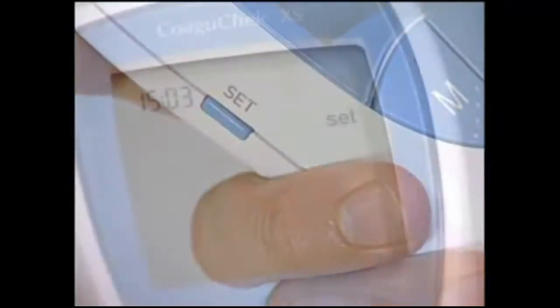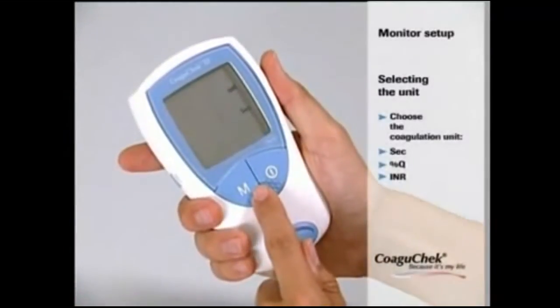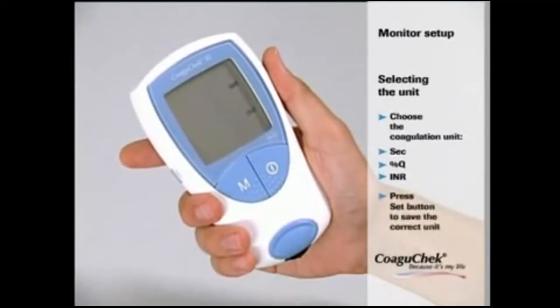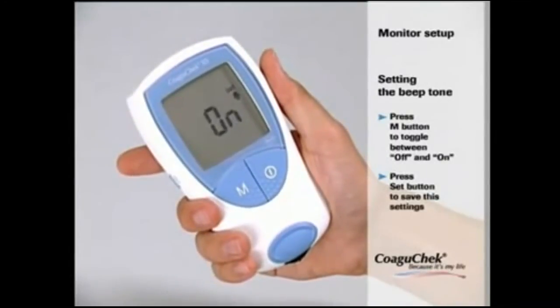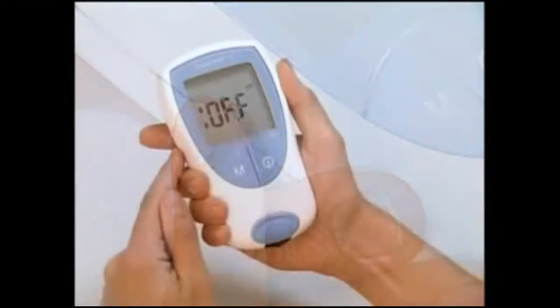It is important to select the right coagulation unit. The Coagucheck XS monitor offers three options: seconds, the quick value, and the INR value. Please ask your doctor if you are not sure what to select. Press the M button to move through the three options and confirm your setting using the SET button. You can also choose whether you want the beep tone off or on — it is recommended to leave it turned on. Press the SET button to save your setting.